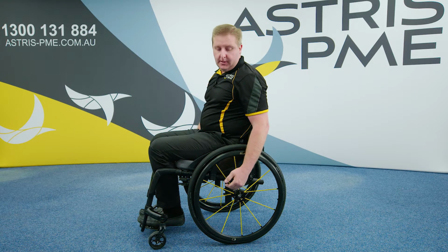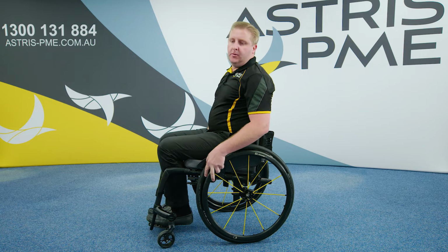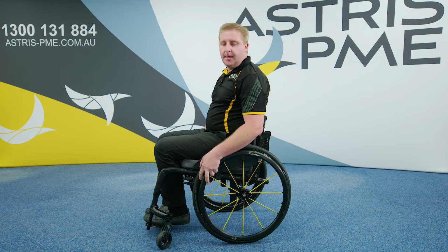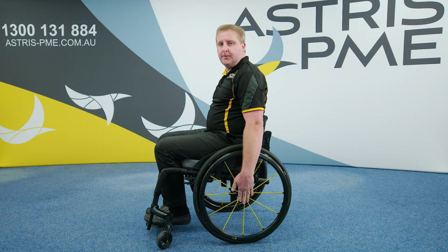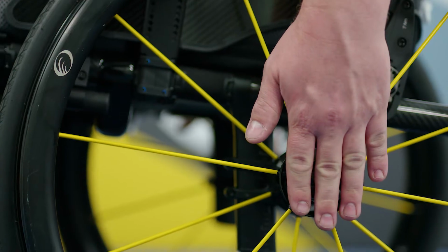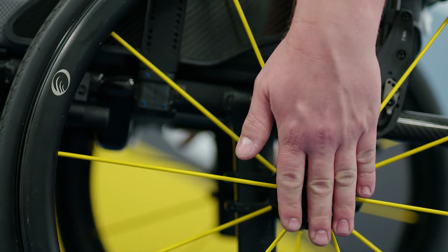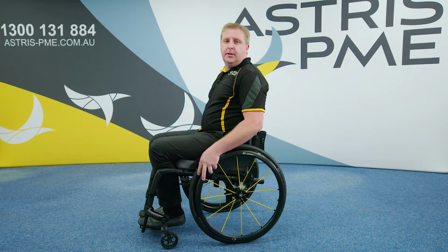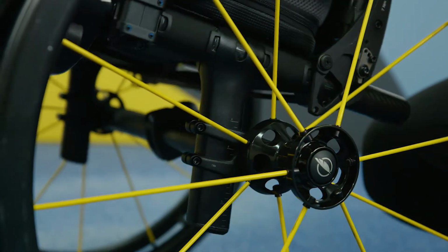A good test for a wheelchair user, or when you're doing a script for a wheelchair, is when the client's seated in the chair to have their hands come down the side of the frame like this, and the centre of the axle should be somewhere between the end of your fingertips and the centre of your palm. The setup of your rear wheels is important to enable the user to have the correct push range on the wheel.